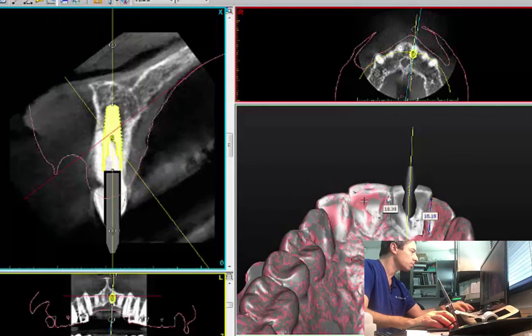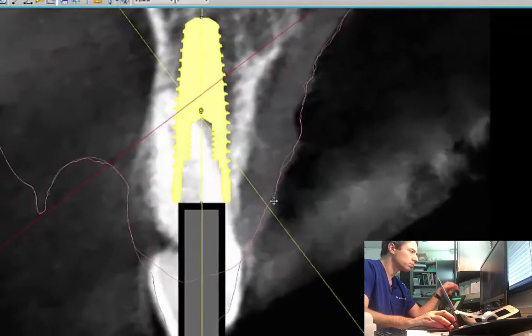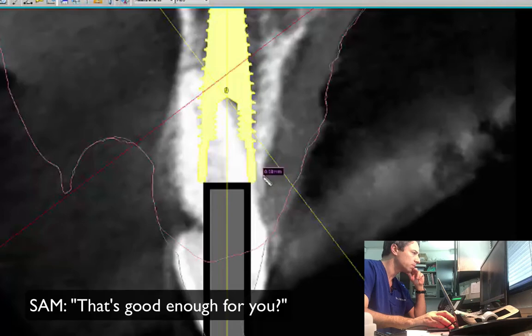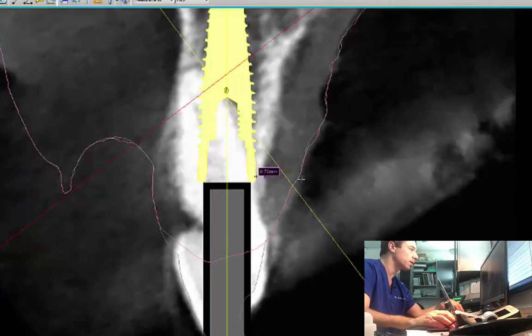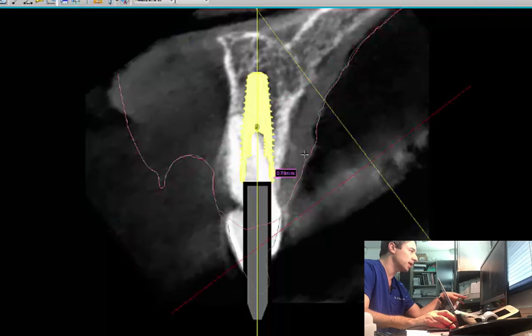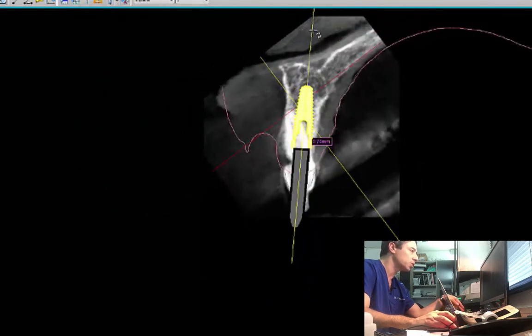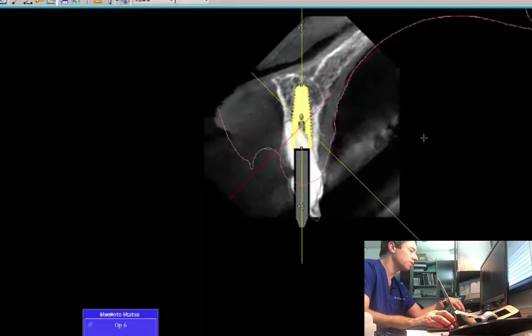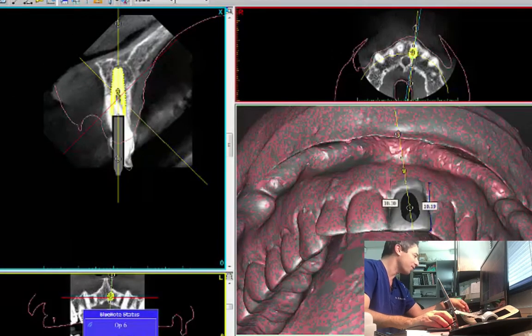Let me undo it. There is about a millimeter of bone, probably. That's good enough for you? Well, I prefer that than having the implant too close to the buccal. But listen, anywhere we look at it — from a surgical perspective this is the safest — but from a restorative perspective, it's not going to work for us.